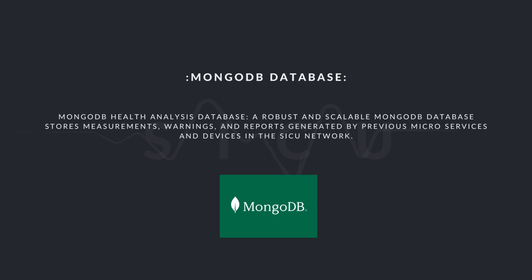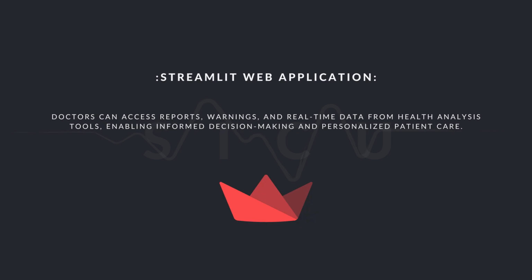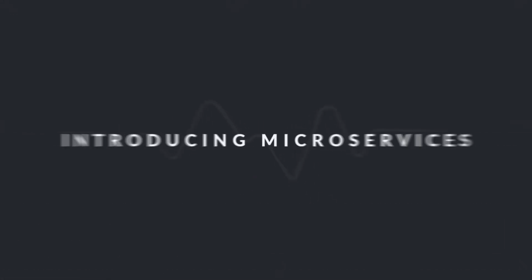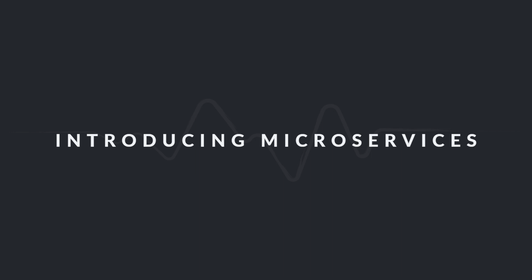And finally, SICU benefits from two different user interfaces, including a web application based on the Streamlit platform, that can be used on every browser-based platform like mobile phones, desktops, or tablets. And also another user interface, which is a Telegram bot, which can be accessed in Telegram Messenger. All these microservices work together in order to gather, analyze, and visualize the information created by our Raspberry Pi devices, which are a gateway between the sensors and the different microservices in our platform.